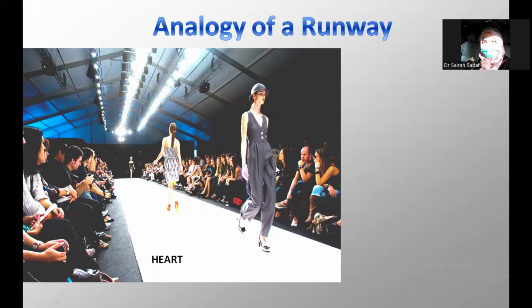She's the same. She will not change. The people sitting here and people sitting here, and the people sitting on the front and people sitting on the back side, everyone will have a different image of her. The people sitting here will have her front view, and the people sitting on the back will have her back view. So obviously, at the end, everyone will have a different image of her. So that's why leads are different from each other.